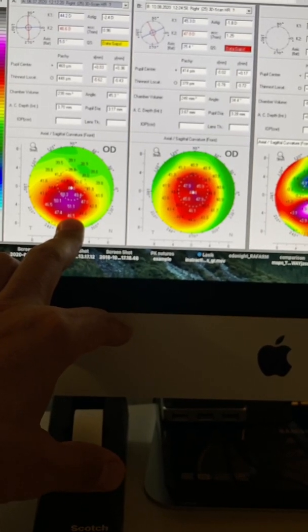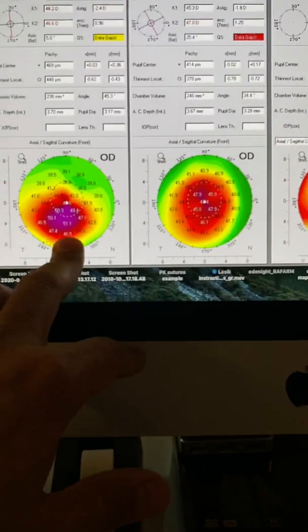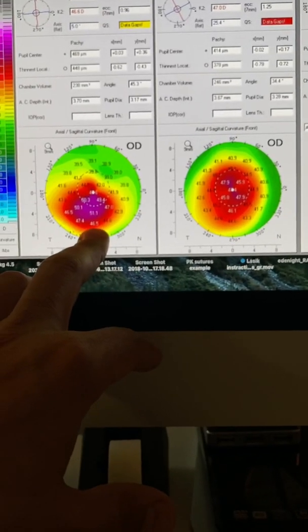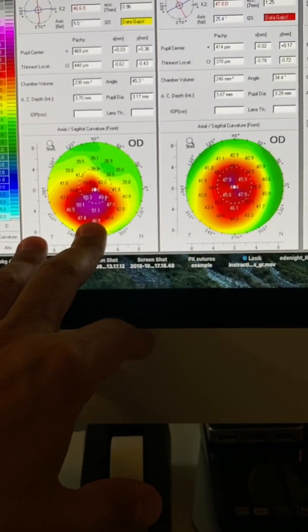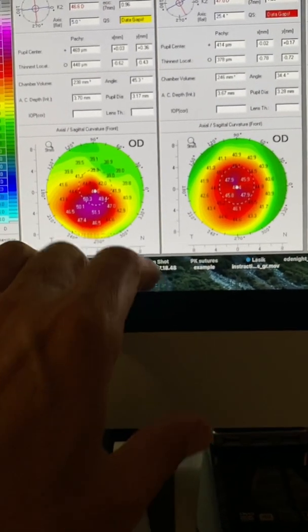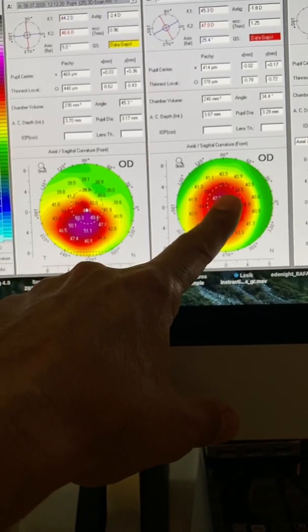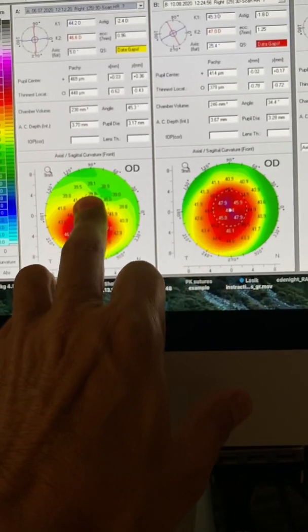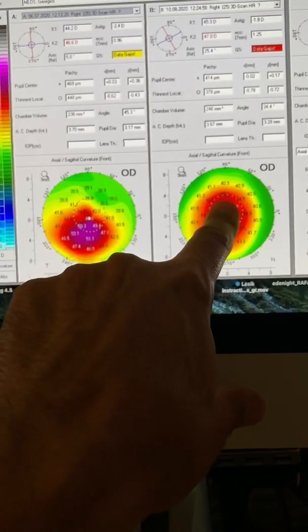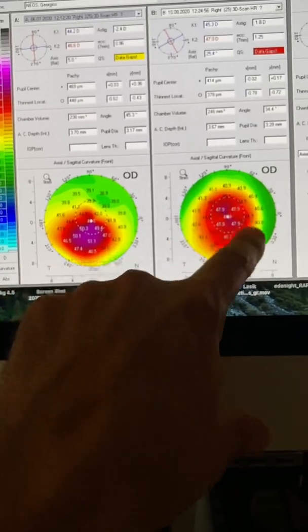Other things to note here, which unfortunately are very commonly under-noticed and under-reported, is the steepening of the superior part of the cornea. See how flat it is here and how now it's steepened and how the cornea has normalized.